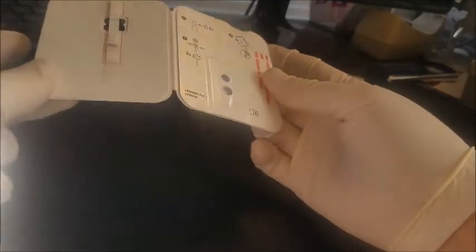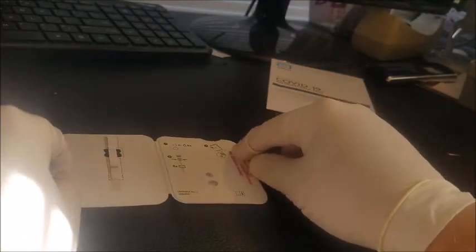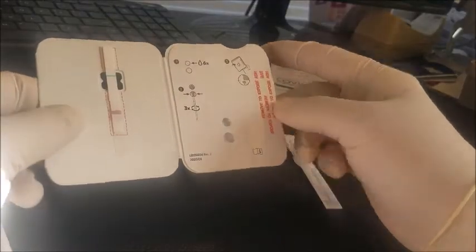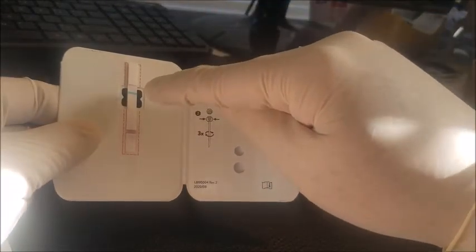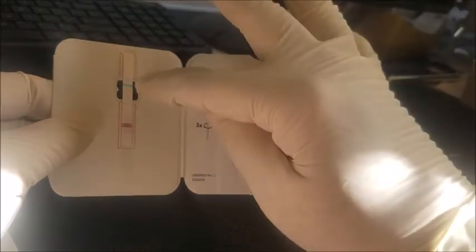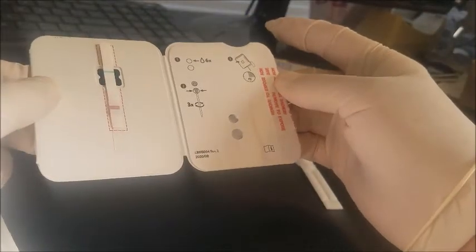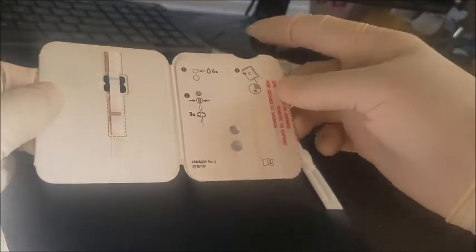So let's start. Basically what you want to do is take the card out of the pouch — I already opened it up. Make sure you don't touch any of the test samples here, and you're just going to hold it down like that. You want to make sure that the blue line still exists, because if that blue line is not on your new test, that means it is void. So make sure that blue is there.